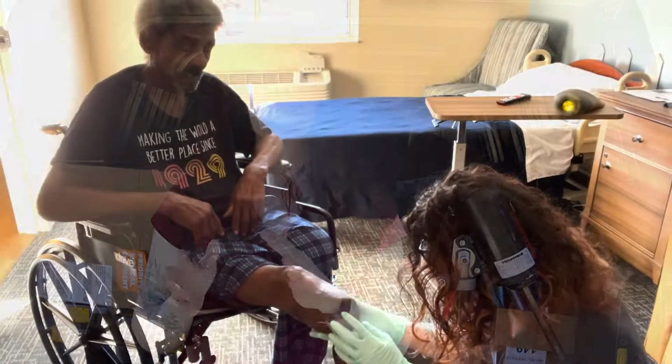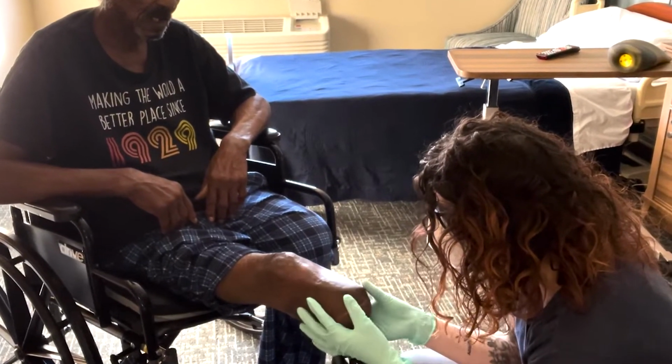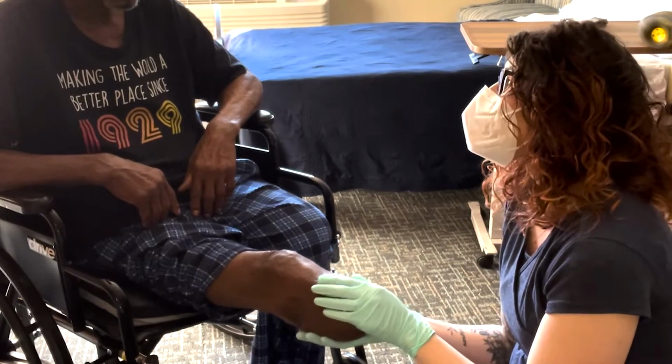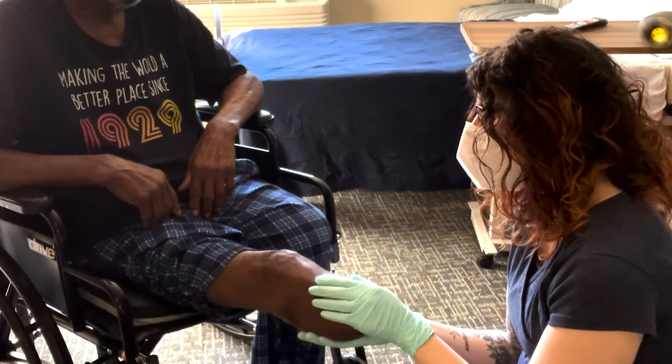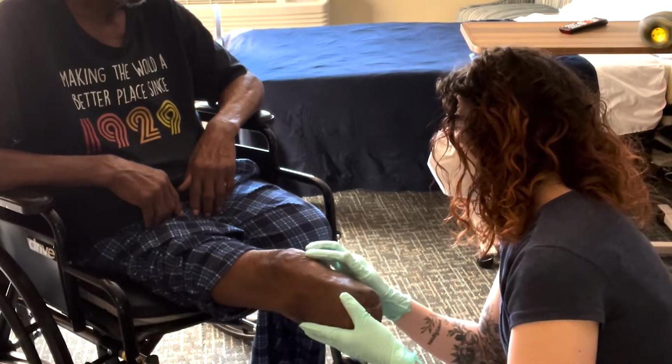Today you're on the road with me as we cast a bilateral patient for new prosthetics. So the transtibial amputation and prosthesis were from 2013. He had a more recent left transfemoral amputation due to poor circulation and blood clots, but he is very independent, very motivated, a strong guy, and wants to get back to walking.